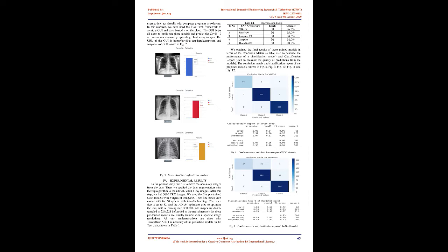In this research, we do not have millions of labeled data to train such complex models. Transfer learning is used to solve this problem. Transfer learning 5 is an approach to store the knowledge gained while solving a problem and apply it to a different but related problem. It can train deep neural networks with a comparatively small amount of data. We have used several CNN models and analyzed the performance to get the best results.